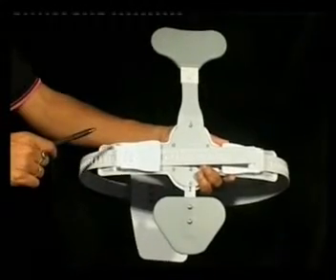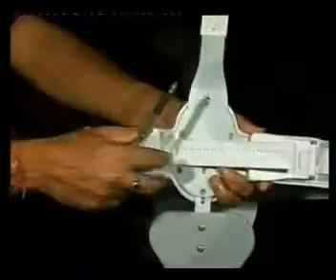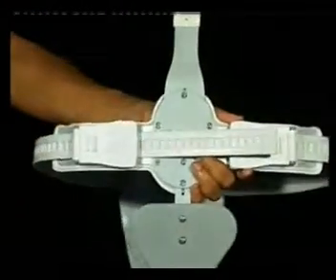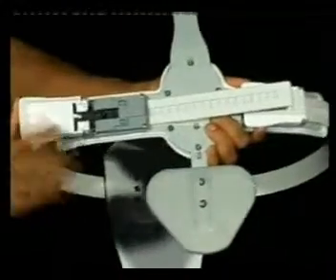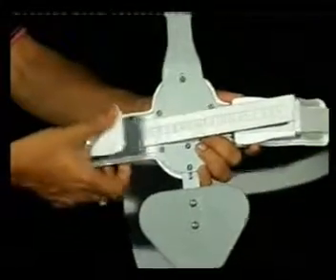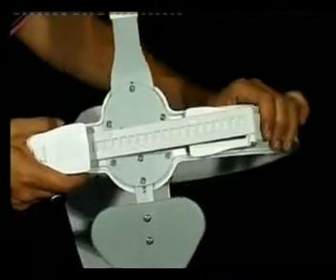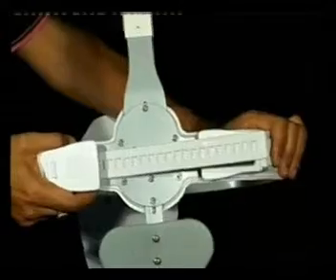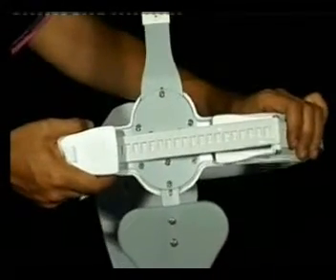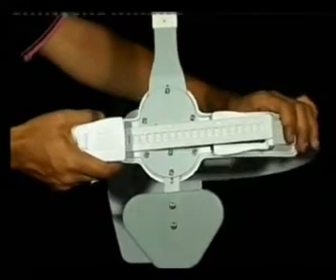Different adjustments are available so we can fit it properly to the patients. This is very easy to wear. This is the ratchet closure system, and when we tighten it, these two supports take the shape of the body automatically. Thus it holds the spine properly and is very comfortable for the patients.